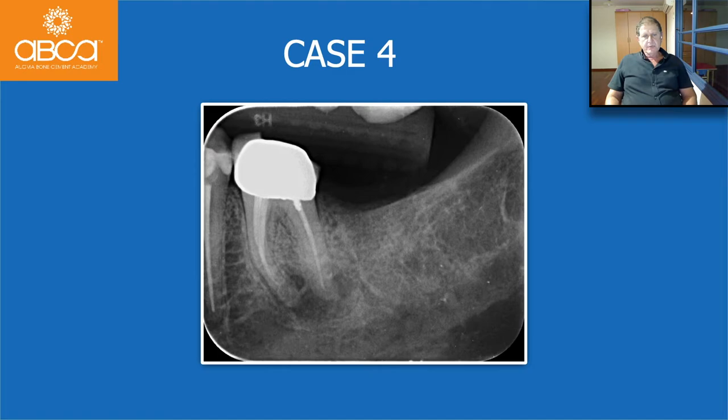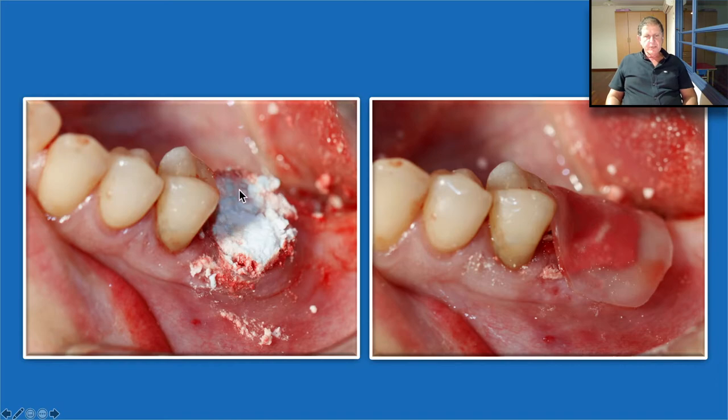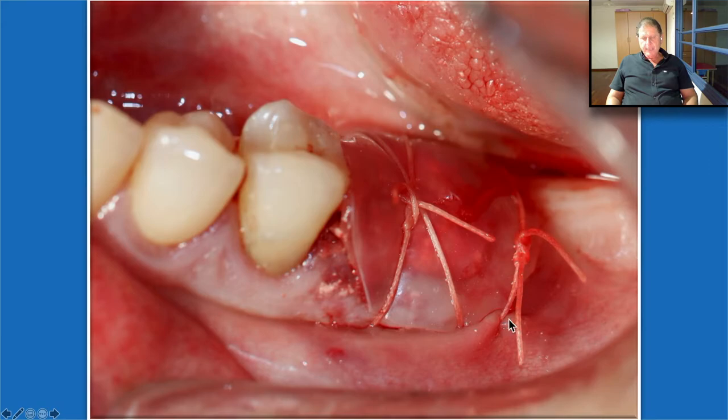Another case: we need to extract the molar. You can see we extracted it — we don't even need to reflect the flap in such cases. But we will have a big gap that will be filled by the Bond Apatite and protected with the Oraid. We inject the material simply as shown. Before applying the Oraid, we take a dry gauze, clean the remnants of cement from the site, then take a gauze, moisten it with saline, and moisten all of the area — this is very important, it gives perfect adhesion of the Oraid. The Oraid is bonded to the mucosa, and as always we secure it with sutures from one side to the other, and if we want to be more sure, we can add another suture.